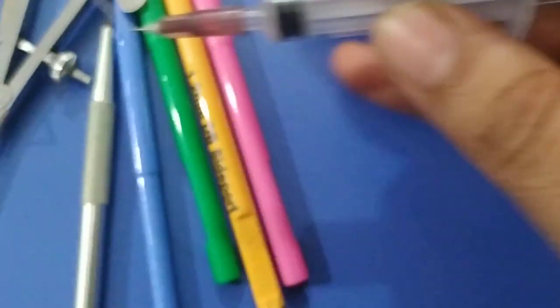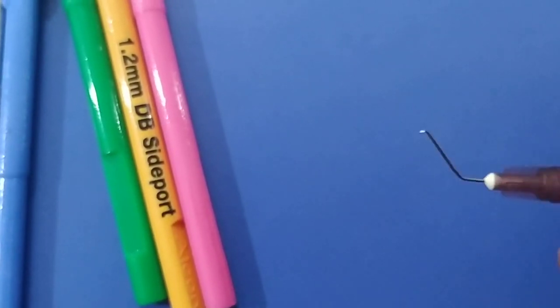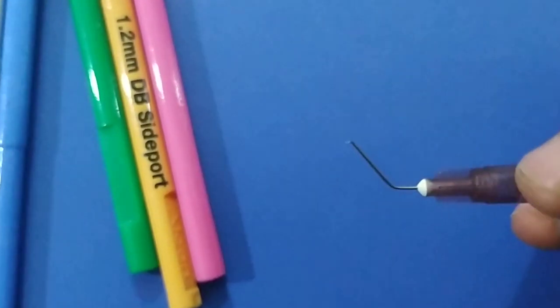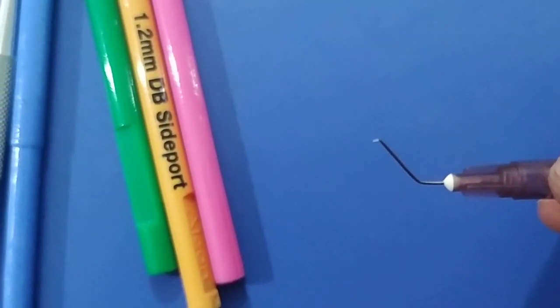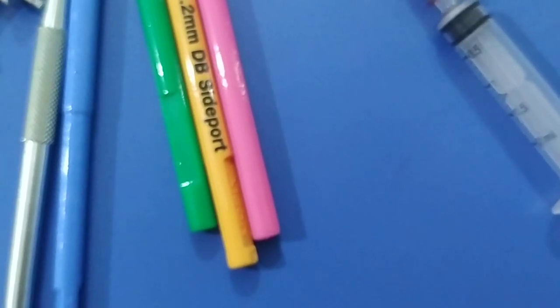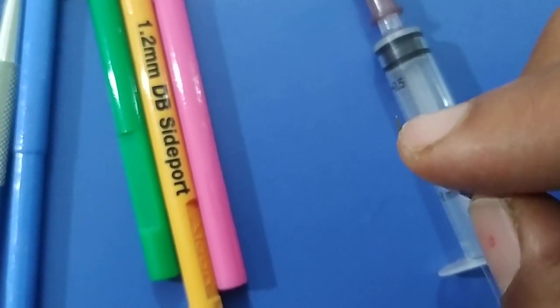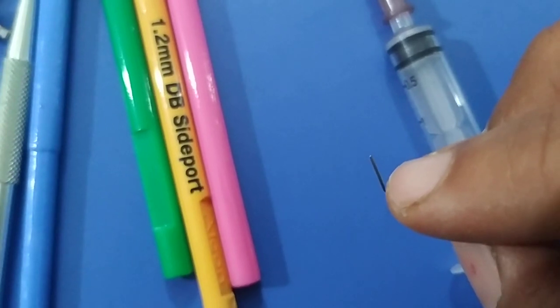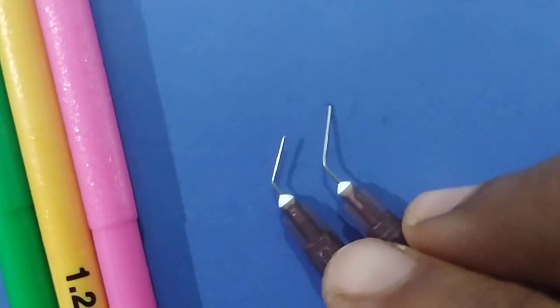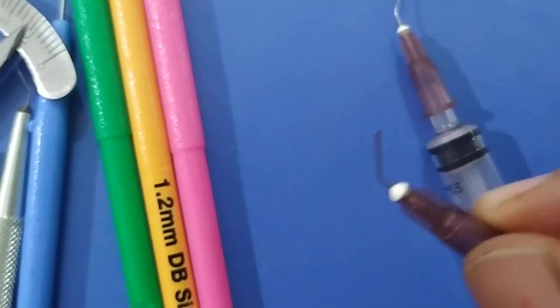This is a cystitome. You can see the tip has one angle here and another angle there — it is made from a 26-gauge needle. It is used to cut the anterior capsule whenever we want to do anterior curvilinear capsulorrhexis or capsulotomy. This is a lacrimal syringing cannula — the tip is blunt and it has only one end. It is used for lacrimal syringing and can also be made with a 26-gauge needle. The difference: the cystitome has a double curve and the lacrimal cannula has a single curve with a blunt end.